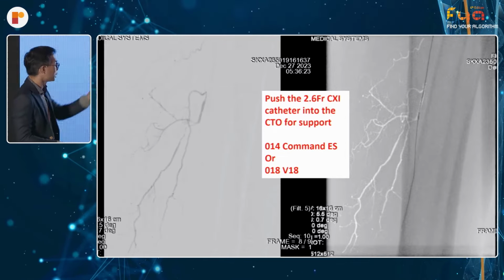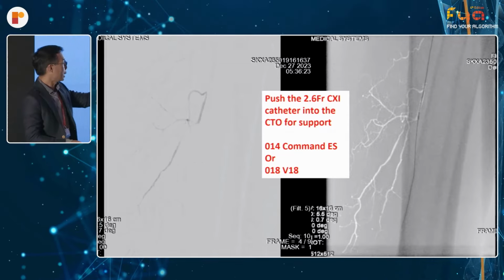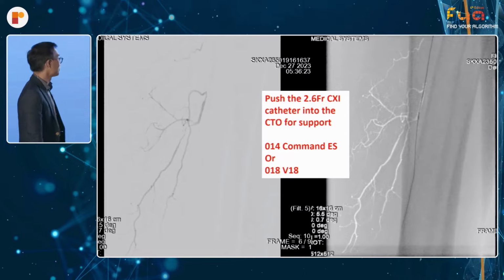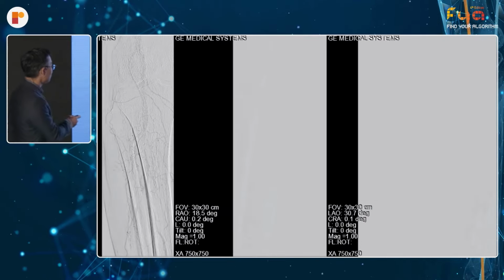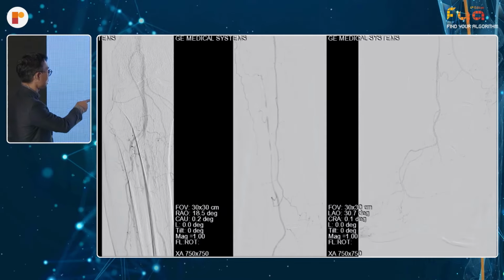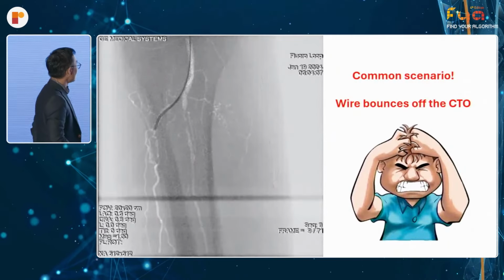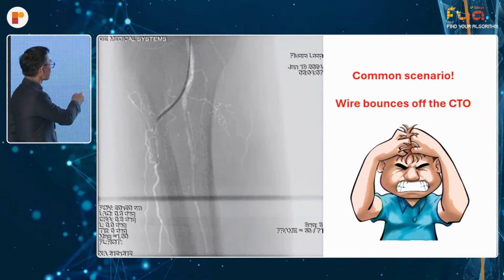So this is my preferred technique. If this were to fail and I were to need more support, then I'll push in a 4 French Bernstein catheter for more support using the telescope technique. So this is another case of a complex BTK case with the only runoff being the peroneal artery. You can see a nice reconstruction of the distal anterior tibial artery, and that's the target artery down to the foot. And in this case, I put in the 4 French Bernstein catheter.